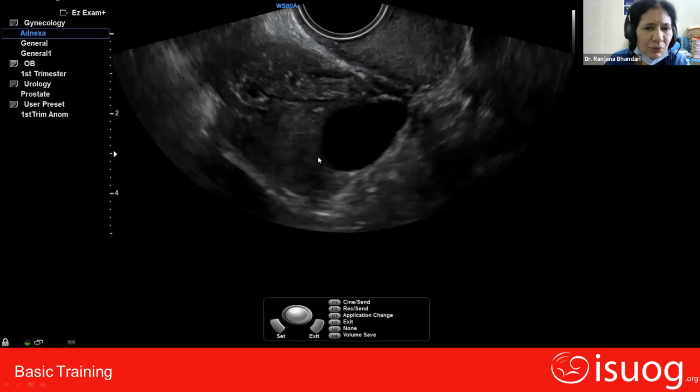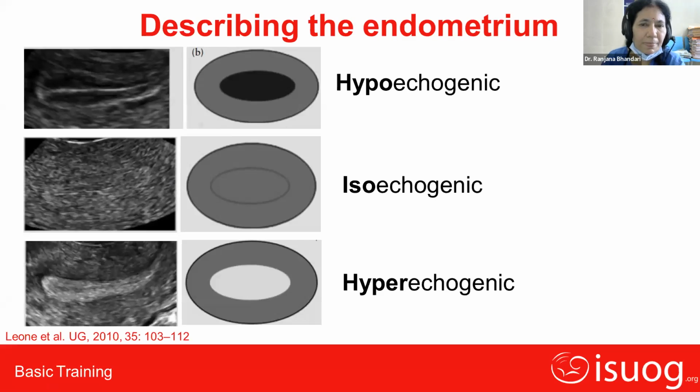This is also how to see the endometrial thickening, but I have already given this video before. Now, we have to describe the endometrium. I'll just tell something later. According to IETA, I will show how the endometrium is described.